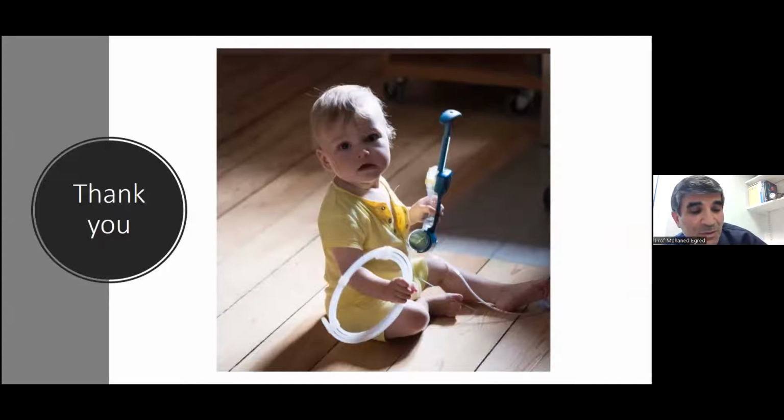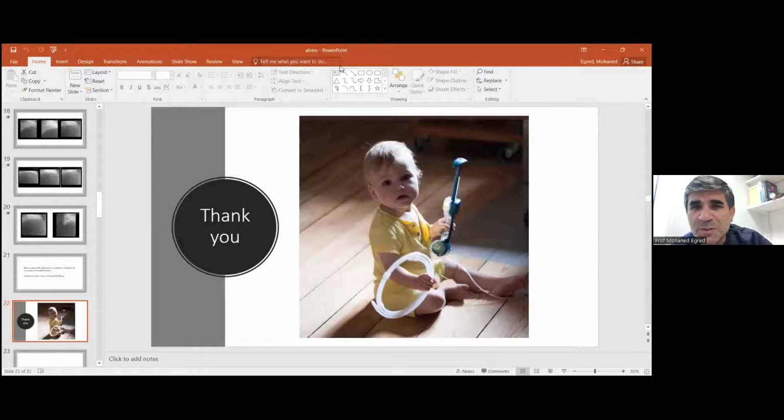I'll just say, there's a lot of equipment, a lot of balloons, and everybody tells you the balloons are good and this and that. But I think experience tells us that there are few on the market that will allow you to achieve a good outcome. Alveo is one of them. No equipment is going to always be 100% successful, but it's the percentage of success that makes you lean toward one thing or another.